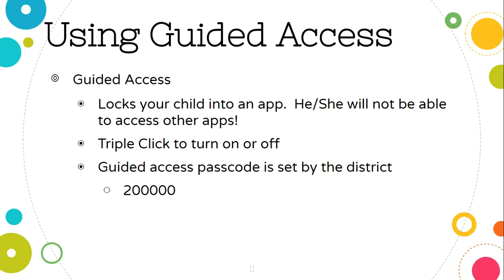So for example, if they go into YouTube and you set them up with a video, and then all of a sudden they realize that's not the video that they wanted, they now don't have any way to tell you that that's not the video that they want, because their voice is in another app. And as you may or may not know, on iPads, you cannot run two things at the same time. And so we want to make sure that they only use this iPad for their voice. And then if they do need something like additional educational apps or access to YouTube or something like that, they would do that on a different device and they could have both at the same time.